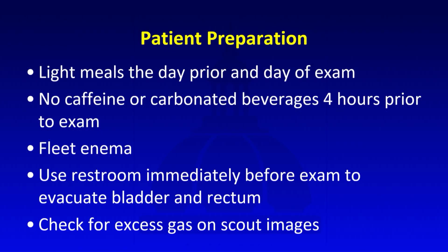And we have really good technologists who are very experienced. So after they put the patient on the table, if they see a lot of the excess gas on the scout image, they would actually ask the patient to go to the bathroom again. Because there's no point in proceeding if there's a lot of gas in the way. That's just going to ruin your diffusion weighted images, and you have to call the patient back.